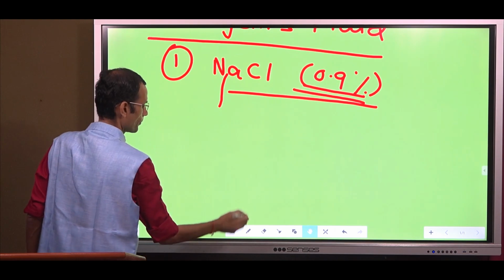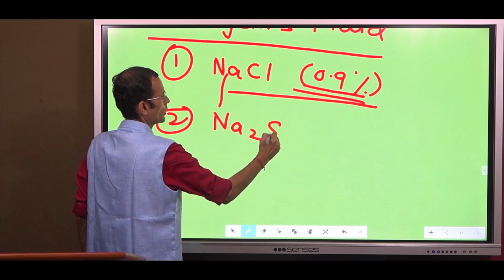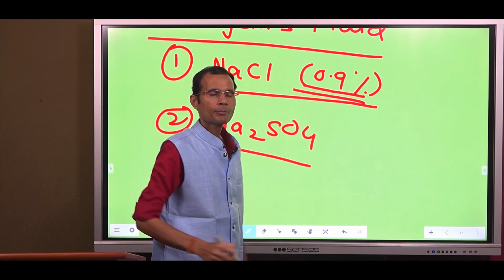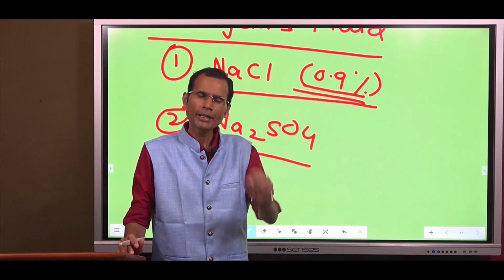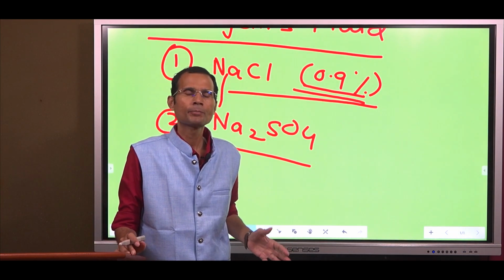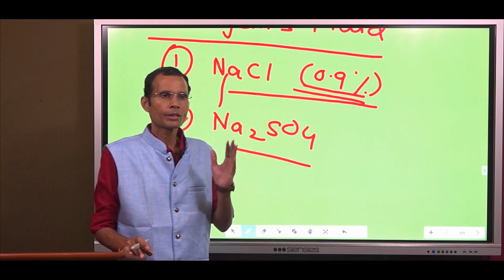next, sodium sulfate. Now here, many authors have suggested that it acts like an anticoagulant. Let me make a point.